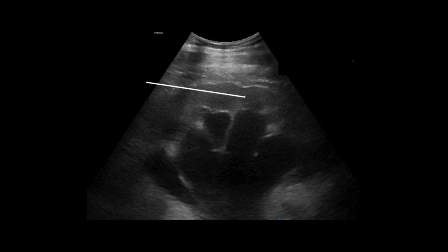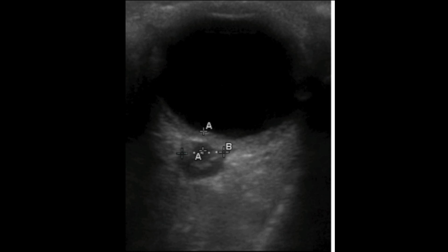So we talked about that. So this is the eye. So maybe it's not that useful for us because we CT patients, but this is how to look for raised intracranial pressure. Obviously we just do the CT scan once. It's not something we repeat within 24 hours oftentimes. So maybe it's not helpful for us, but I think if you're in Beaufort or somewhere else, you're not sure, is this guy just drunk, was there really something else, and you do find that it's abnormal, then that really raises your suspicion.